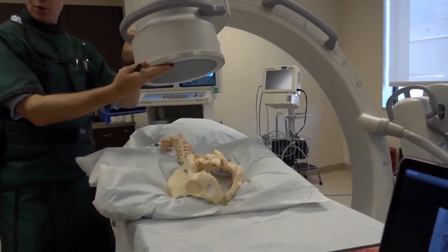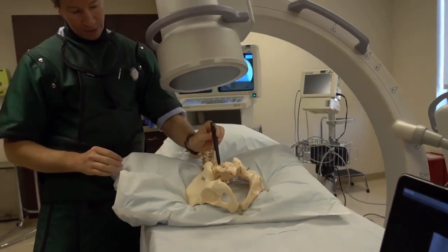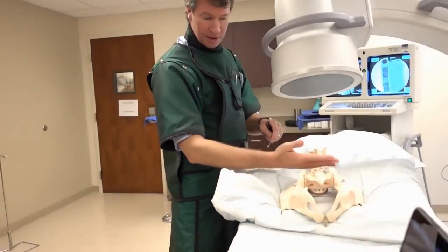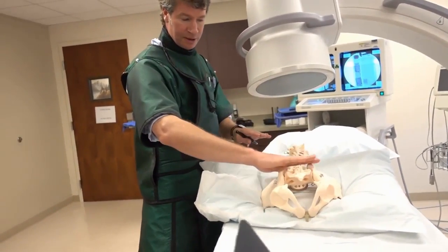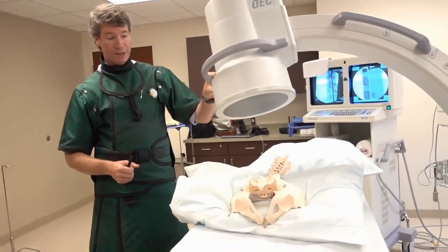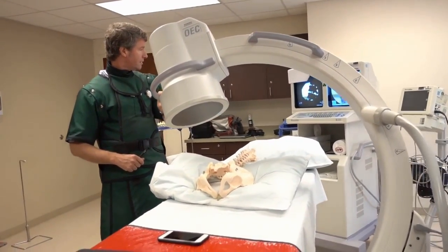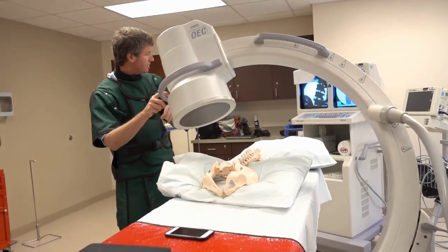You want the C-arm to be oriented so the disc would be in plane, right, like that. And if you look at the skin of the tush, it's going to be parallel to the skin of the tush. You make the image intensifier parallel to that, and then what you would do is you'd simply go into the oblique position to show that projection of the Scotty dog view. It's not going to be good with this. It's not at all.